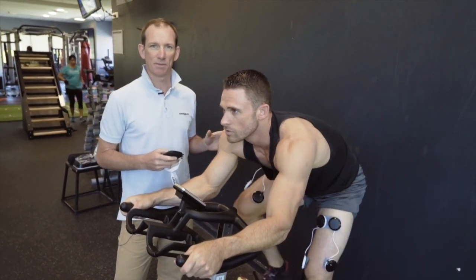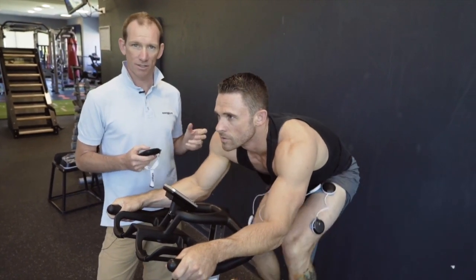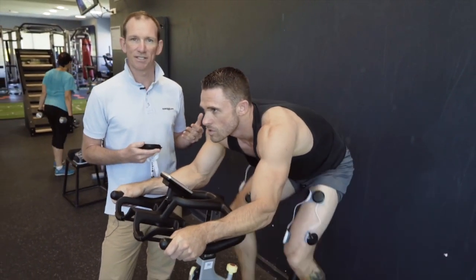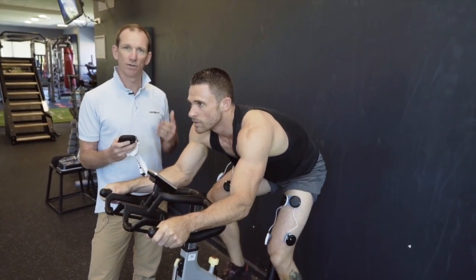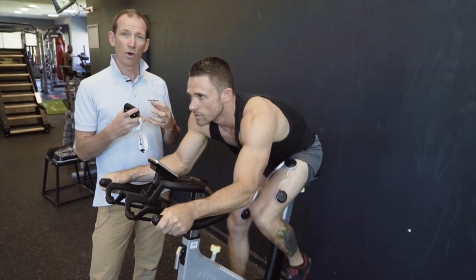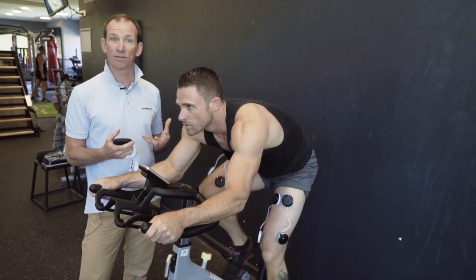So here we have the athlete positioned on a bicycle where we have Compex on his quads, and the idea here will be to increase intensity during a contraction stage, which are happening right now, and keep going, and I can increase intensity here and then stop and slow down, and then during the recovery phase of the cycle we get the athlete just to slow down. And again, what we're doing here is we're firing and we're asking for all of the muscle fibers to contract during the exercise, as opposed to without the Compex, where this wouldn't be the case.